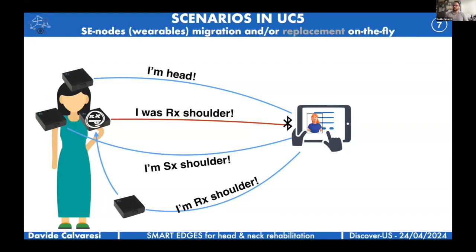runs out, or the sensors of the device, the nodes, start giving wrong inputs that are detected by, for example, the tablet in this case, which is the local controller. And then a sensor needs to leave, or it just commits mutiny, and we are left with only 2 operating sensors. At this point, thanks to the semantic infrastructure that we have set in place, a new sensor could seamlessly join the network, understand where it is going to be placed and which functionality it needs to solve, and blend in, so that the architecture and all the practices will not be affected.